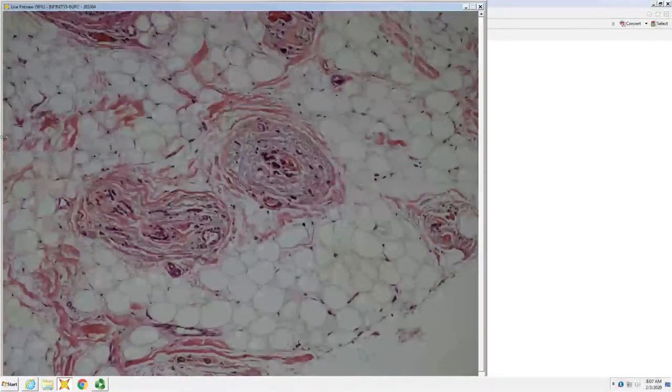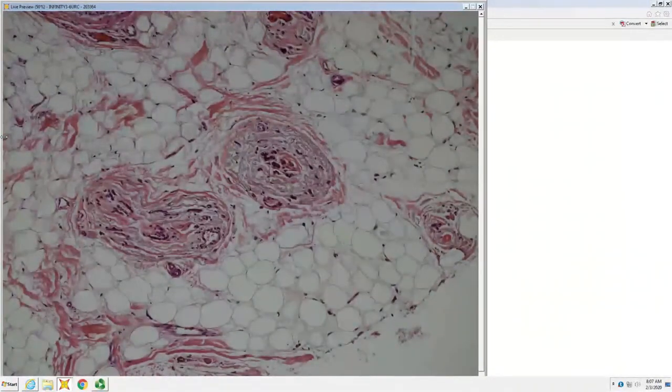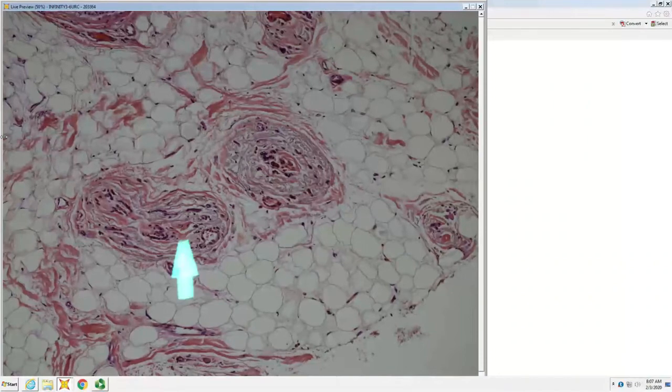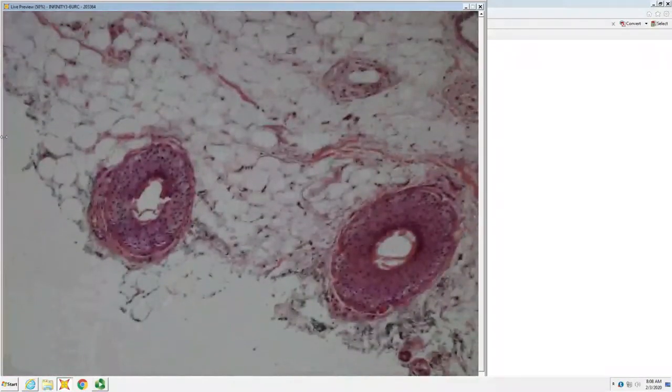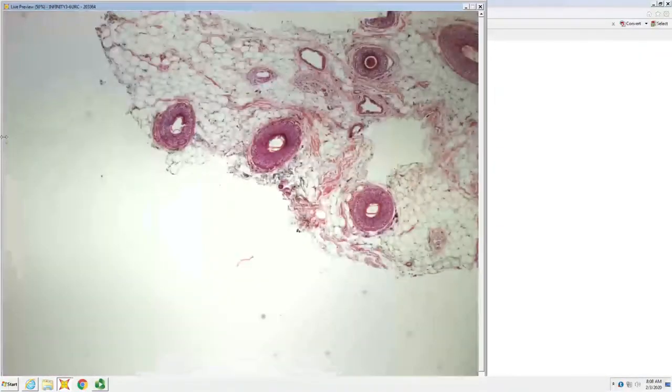Are there EOs? Yes. Those are some erythrocytes. So they're just normal fibrous tracts. So this was pattern alopecia, but eosinophils and pigment in the fibrous tract remnant would be things that lead you towards alopecia areata or syphilis. Every time you say AA, you have to say syphilis as well.